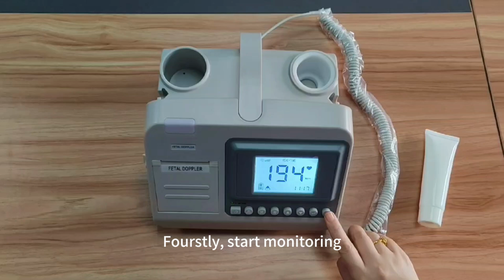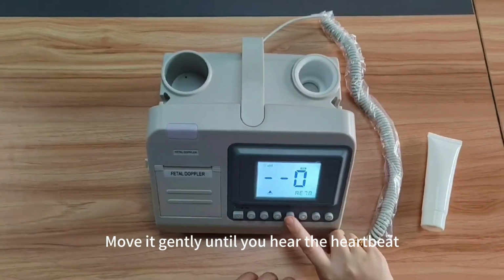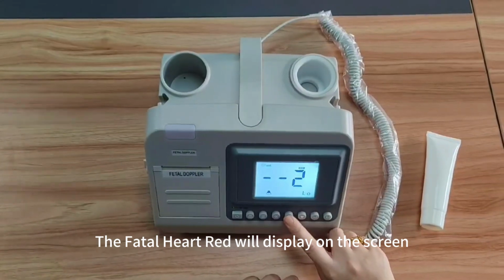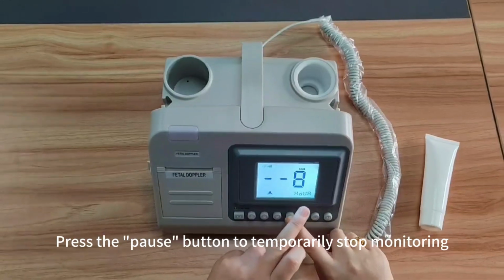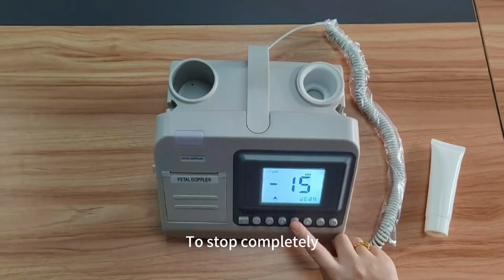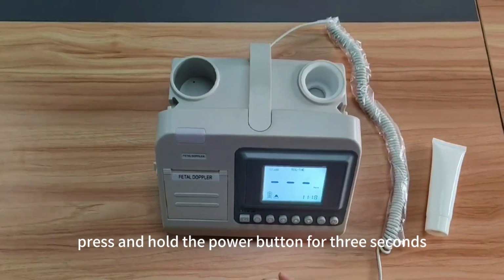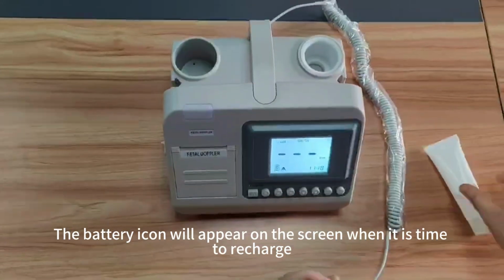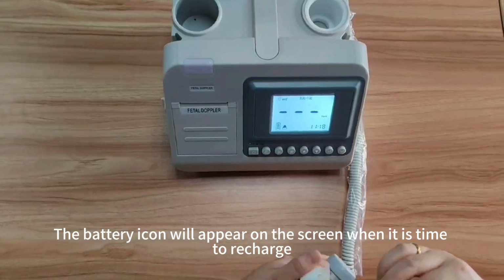Fourthly, start monitoring. Place the probe on your belly. Move it gently until you hear the heartbeat. The fetal heart rate will display on the screen. Fifthly, pause. Press the pause button to temporarily stop monitoring. To stop completely, press and hold the power button for 3 seconds. Finally, battery check. The battery icon will appear on the screen when it is time to recharge.